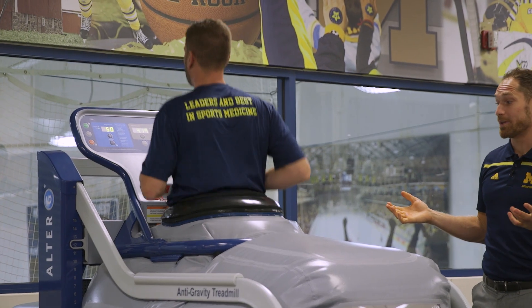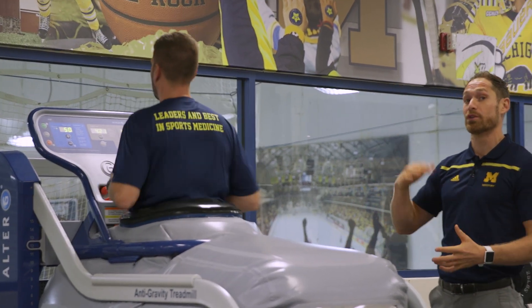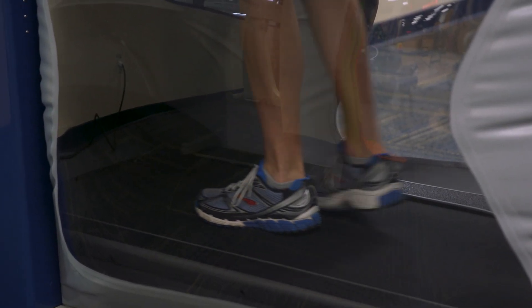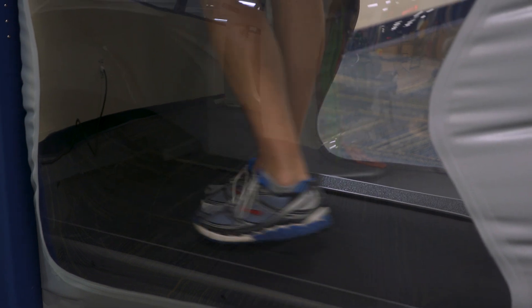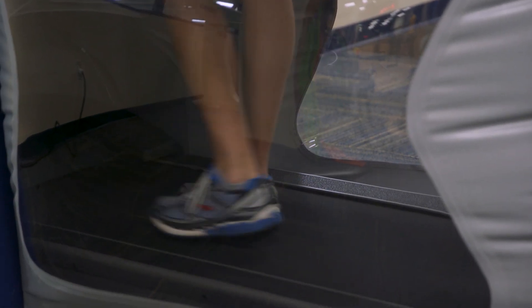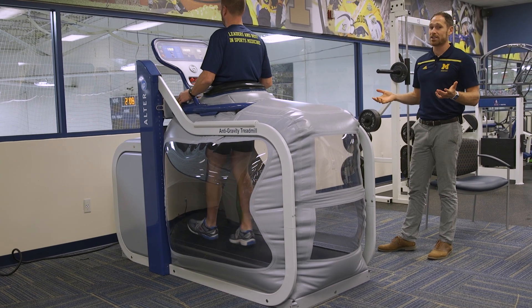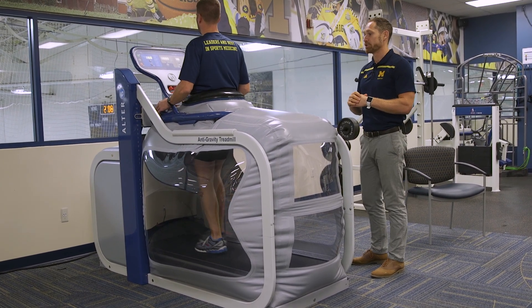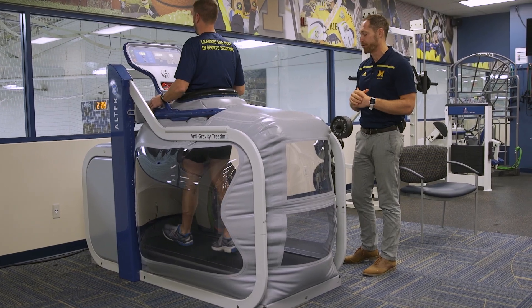The nice thing about this treadmill is it goes forward, but we can also do reverse. So if we're working with someone on gait retraining, we can do backwards walking — retro walking. If you're working on someone to improve their knee extension with ambulation, it'll go up to three miles per hour for backwards walking, but up to 12 miles per hour when it's in forward mode.